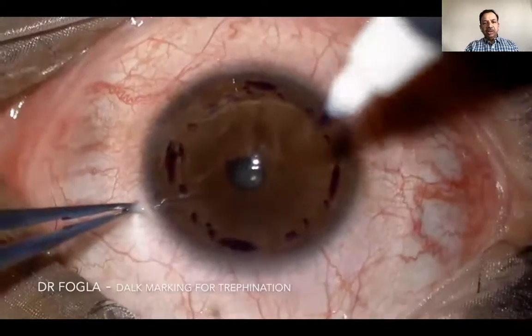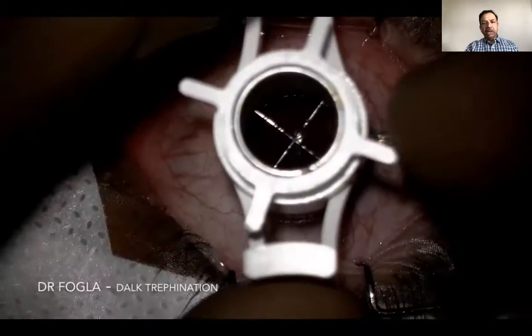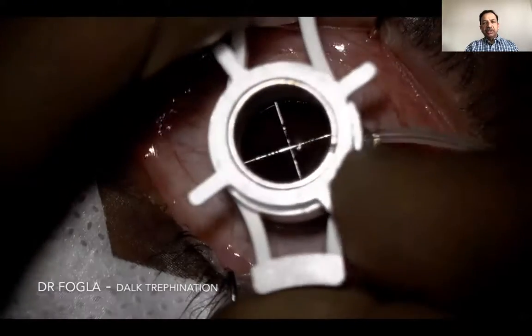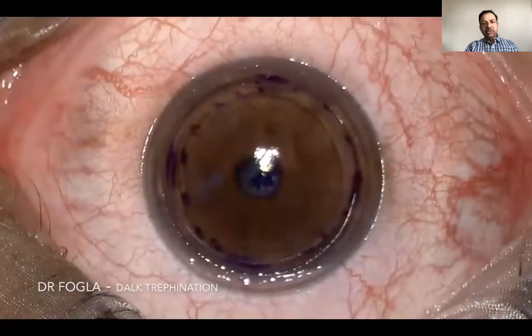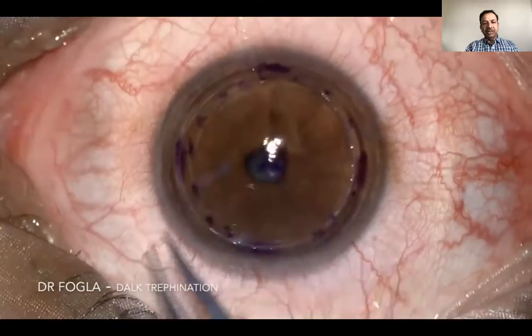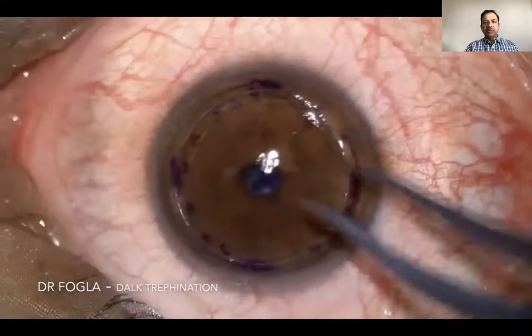Then we mark the trephination, which is a 9 millimeter mark. And then we apply our suction trephine. The trephine is centered so that it touches all the 4 marks that we made, 2 horizontal, 2 vertical. Once the trephination is performed, you find that the cut has gone through all the 4 marks, giving you excellent centration.